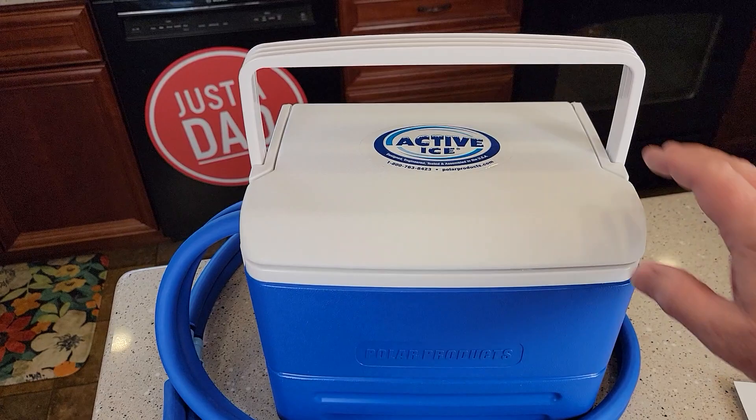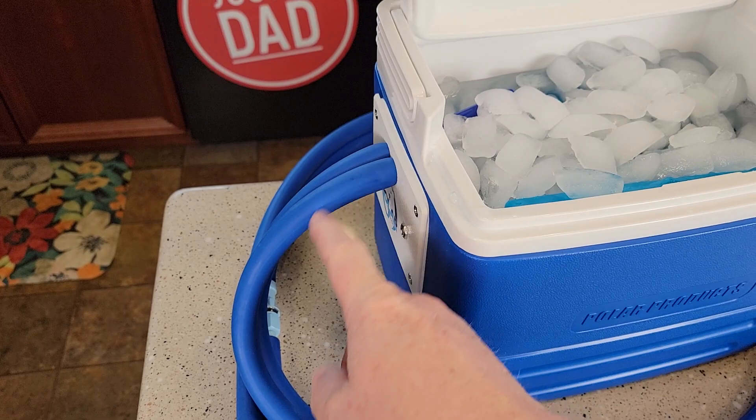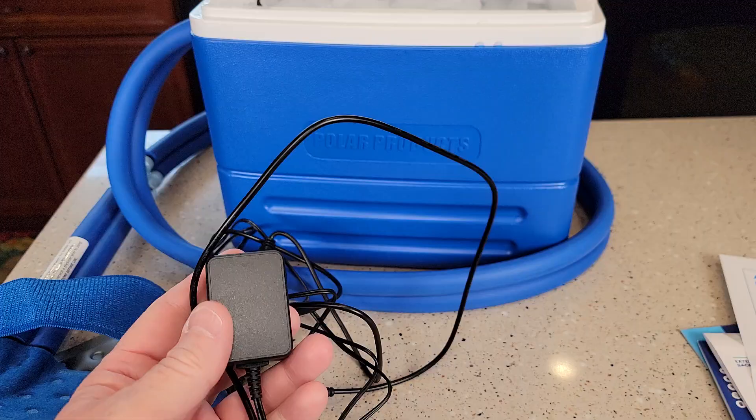Hello everyone. This is Just a Dad. Today I'm going to do a review on this Active Ice Cold Therapy. So this is like a little cooler. It's got a pump in there. I've got mine filled with ice. I've got frozen water bottles in there too. This is where the return water is going to come. We've got two pipes — one pipe carries the cold water and the other one carries the return water back to the cooler.